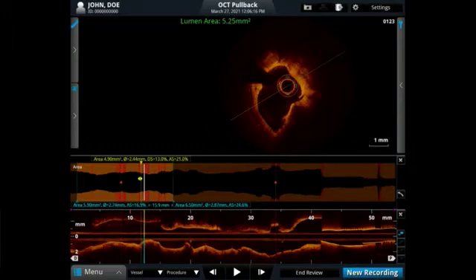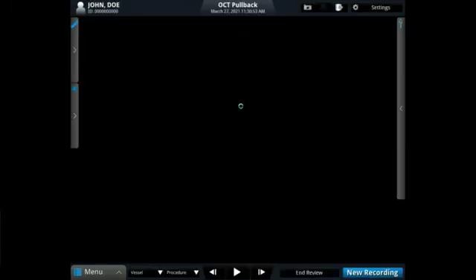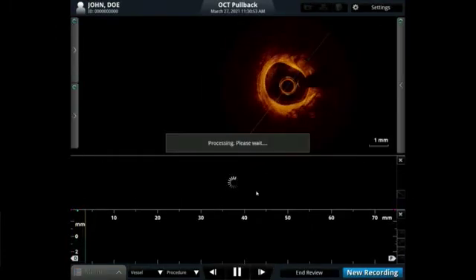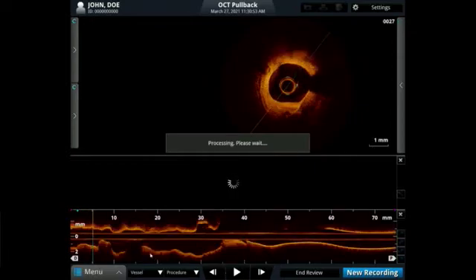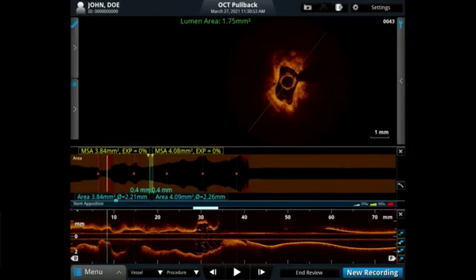Why didn't you just go back to the previous pictures and show us that view on OCT, just to compare, so we have that in our mind's eye? Sure. Remember, this is the nodule, before and after. Give us the MSA in that region. Just put the markers either side of that. So 1.75 or even less on this. This was 1.58. Just put the blue markers either side if you would.